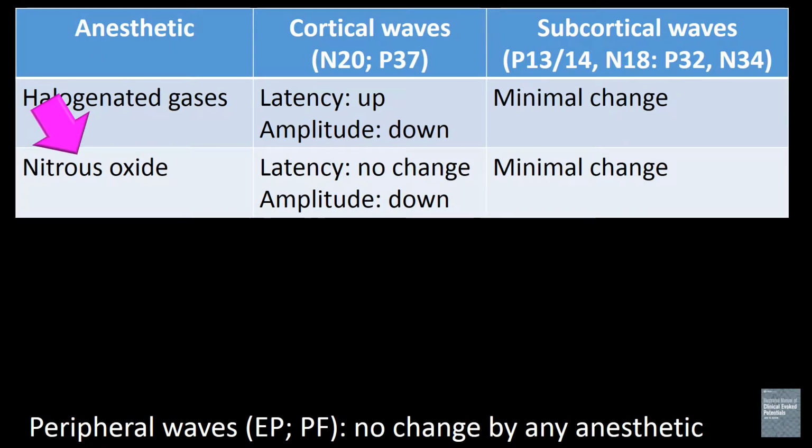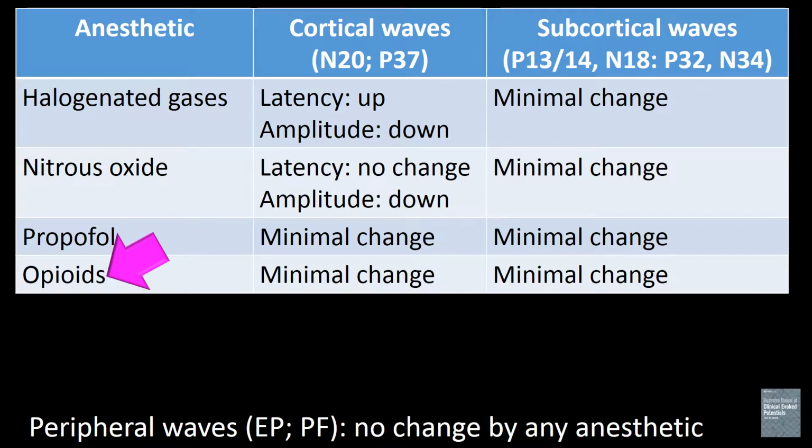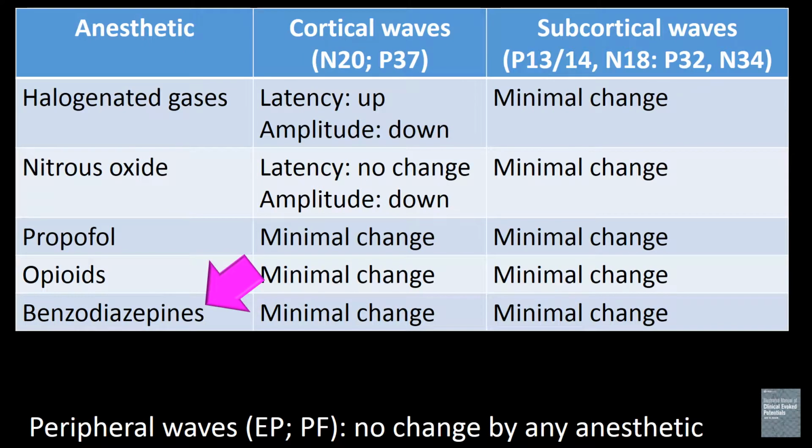Nitrous oxide, another anesthetic, causes minimal changes in subcortical waves. Latency to cortical wave shows no changes, and the amplitude of the cortical potentials is decreased. Propofol produces minimal cortical and subcortical wave changes. So do opioids and benzodiazepine.